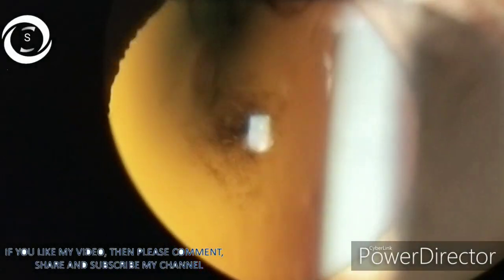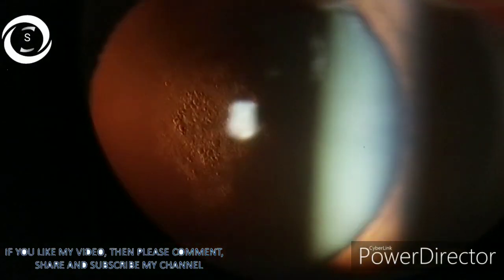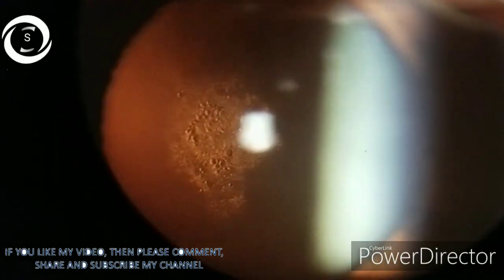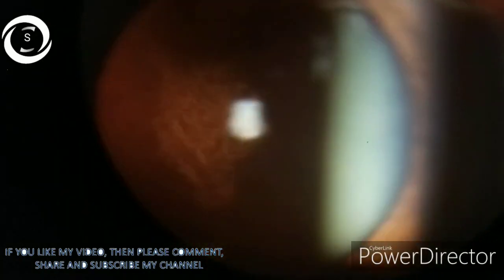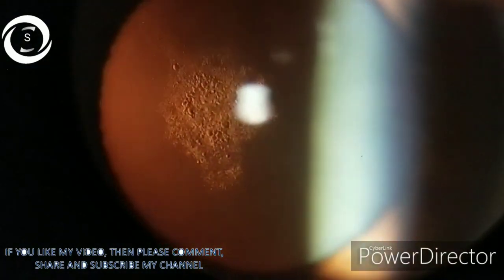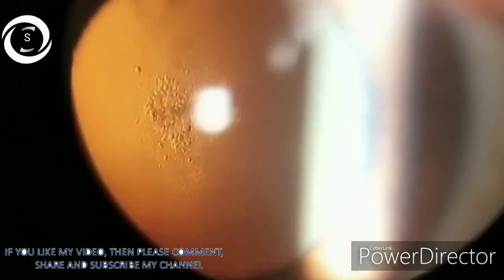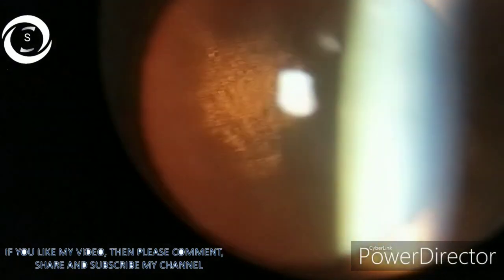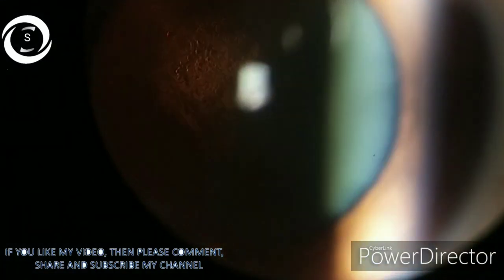I am Dr. Sharjeel, and today I am showing you different types of cataracts through a slit lamp examination technique called retro illumination. Observe the slit beam — it is coaxial: the viewing and illuminating columns are in the same plane, and the slit beam is at the edge of the pupil. Look how beautifully the posterior subcapsular opacities are highlighted against the fundal reflex.